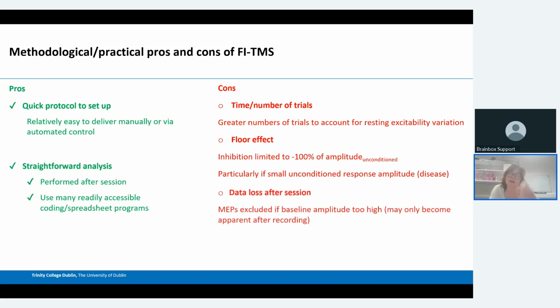And then I just put this in as kind of, it's not necessarily always an issue with fixed intensity TMS, but most people, what they do is they collect their data, and then afterwards, when they go back to the office, they disregard the data where there's this background muscle activity. You can write some codes or protocols to disregard the trials where the person is pre-contracting their muscle during the session and then replace them.